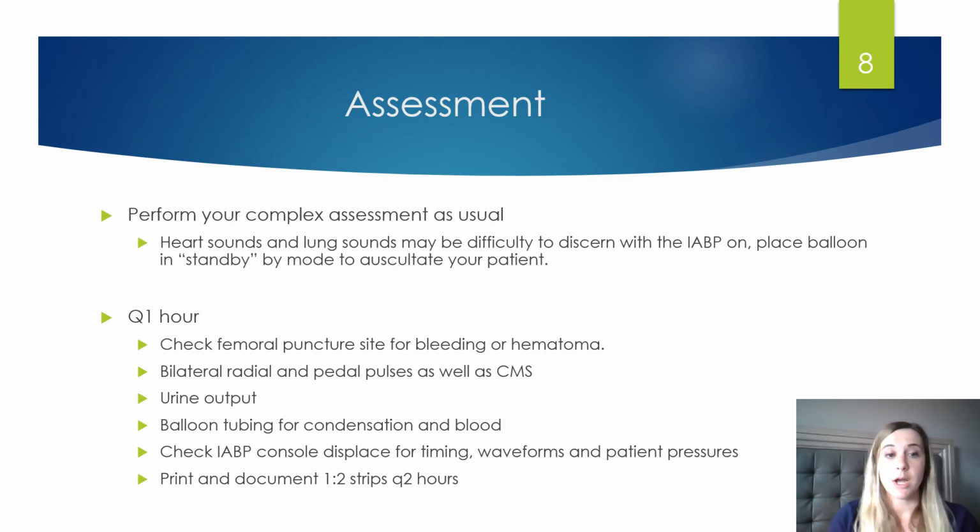We are also going to be checking urine output. So these patients are on strict bed rest. They cannot get up. They'll have a Foley in place, so we're going to be looking for their urine output. Is it going from 150 an hour down to 20 an hour, or are we totally anuric and not producing any kind of urine?